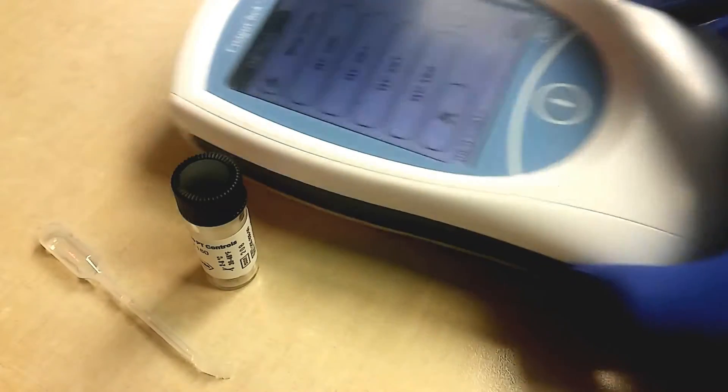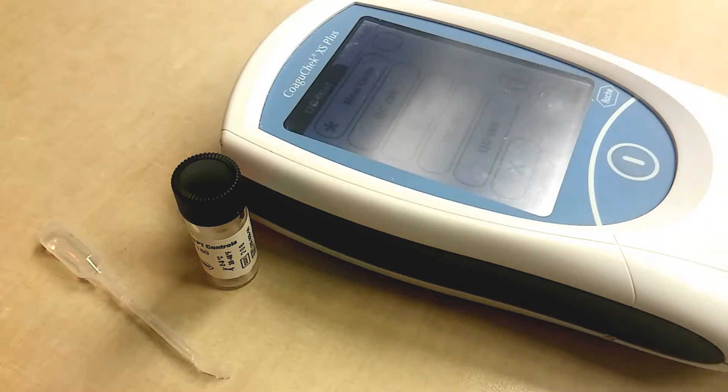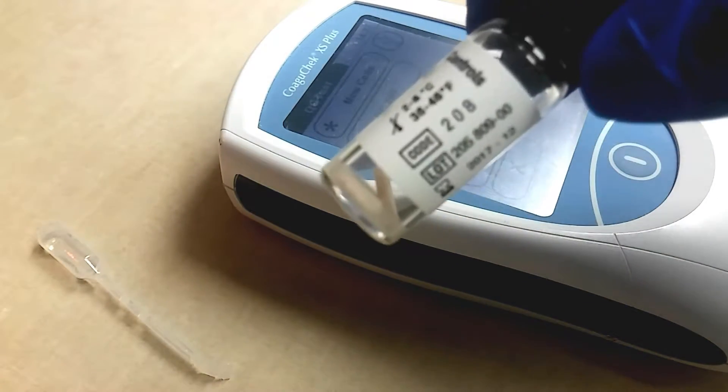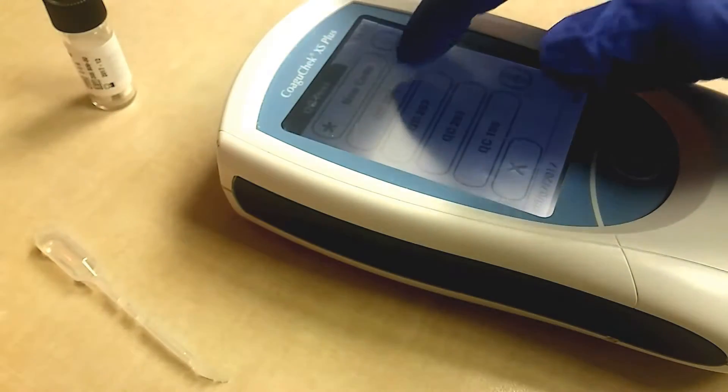The next screen has all the codes for the QC test. What you want to do is check your bottle of QC that you're going to use. This one is 208, so we're going to click on the 208 code.